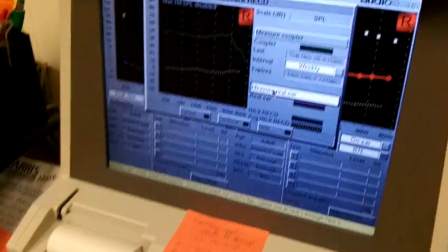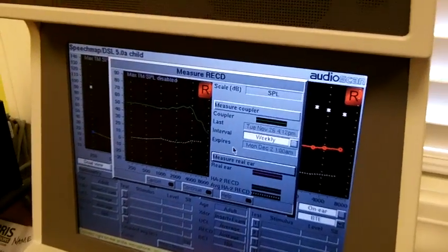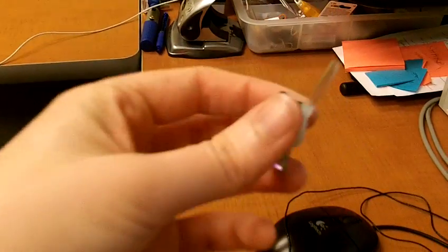Then you're going to measure your real ear, and there is a specific setup for which to do that. So I'm going to switch spots with Amy. Amy's going to sit down. And like I said, we have Jimmy rigged her listening ear mold for a hearing aid ear mold. I've just stuck some tubing on it. So we're going to set this up.